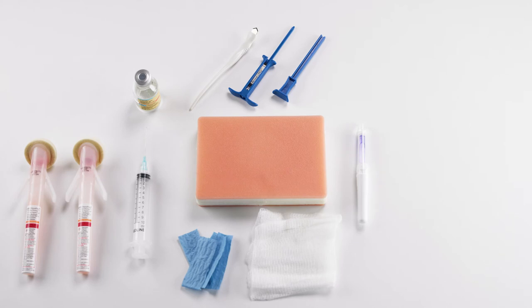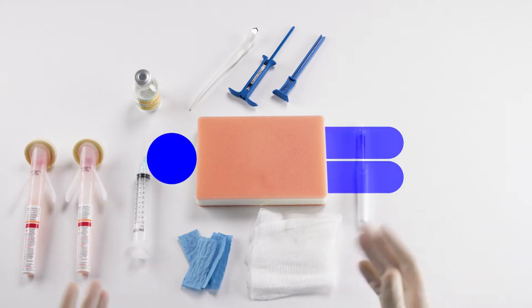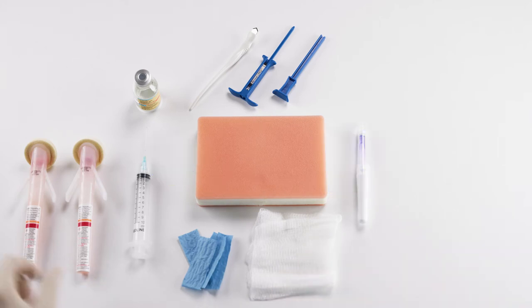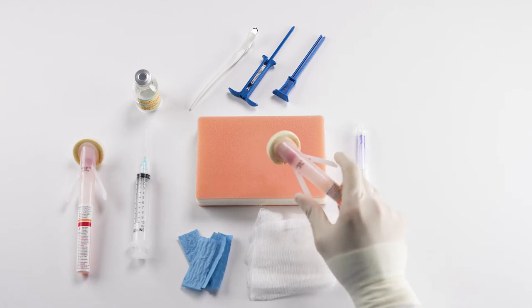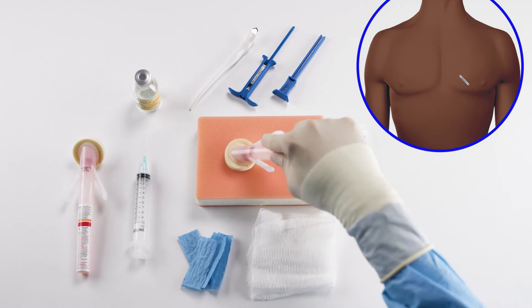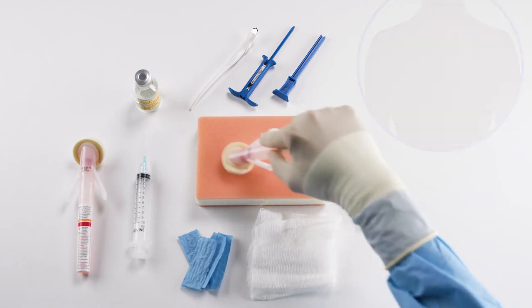We've arrived at the minor procedure room in preparation for the Medtronic RevealLink insertion procedure. Our patient is resting comfortably on the stretcher. I am standing to their right — their head is to my left and their feet are to my right. We've exposed the chest in preparation for the skin chloroprep. I'm going to find the left chest area, crack the chloroprep, and begin small circles to big circles to prepare the skin.